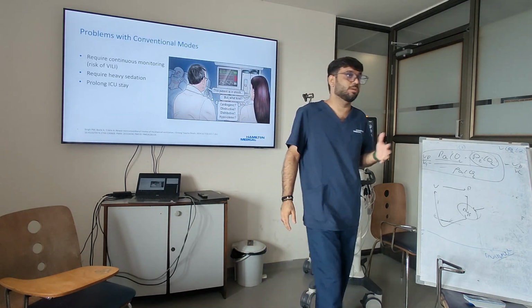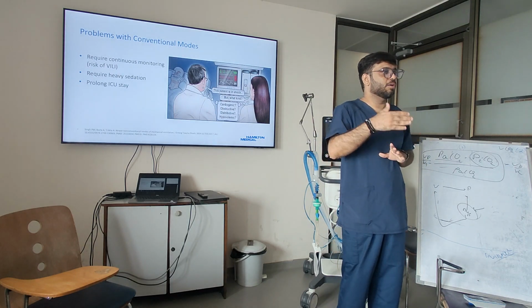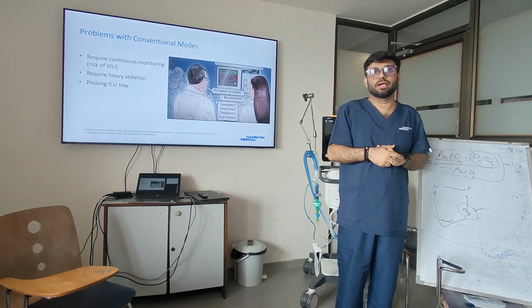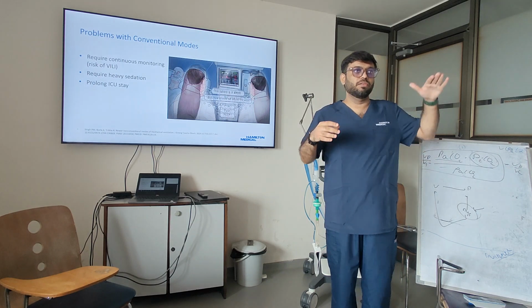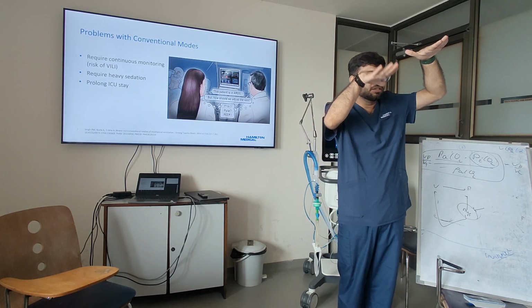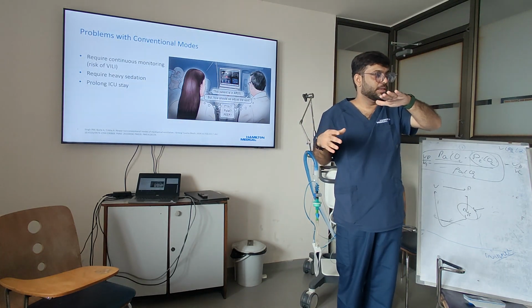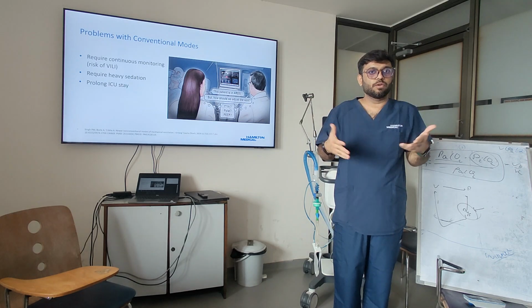It also requires heavy sedation, as Sarmas highlighted initially, and with that it will also prolong your ICU stay. Because with all the open loop modes we are going with the flow. We start with a mode, and then we change the mode from passive to active modes. For that we will of course require more intervention.